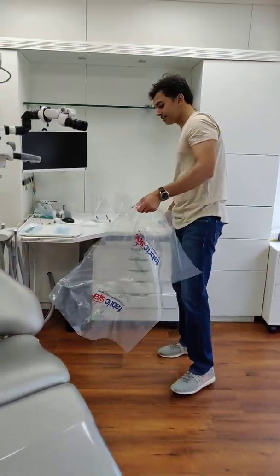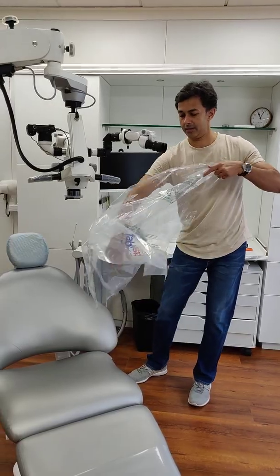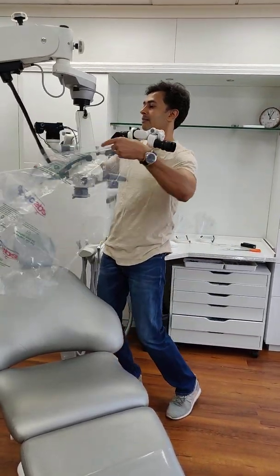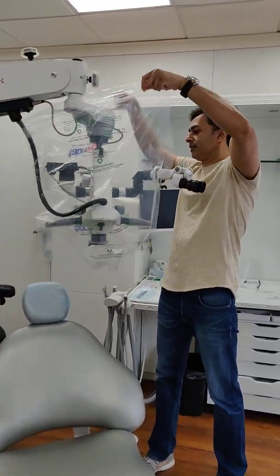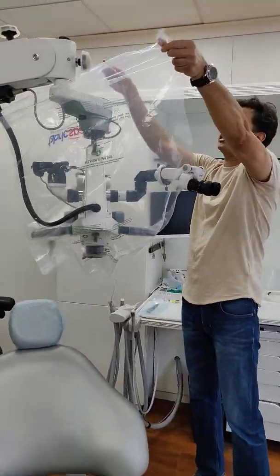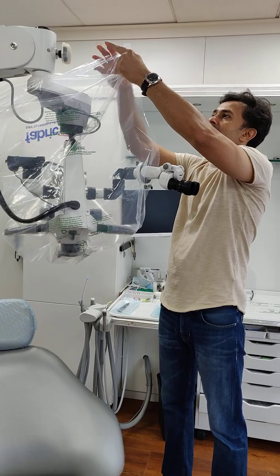Once that's done, we bag the scope. Once you bag the scope, we tie this part here on top.